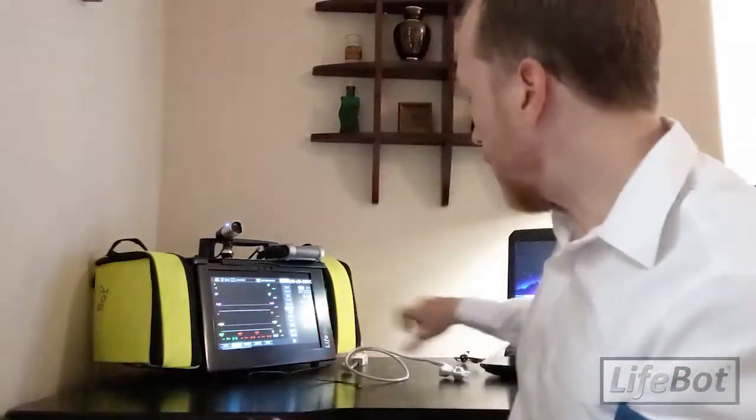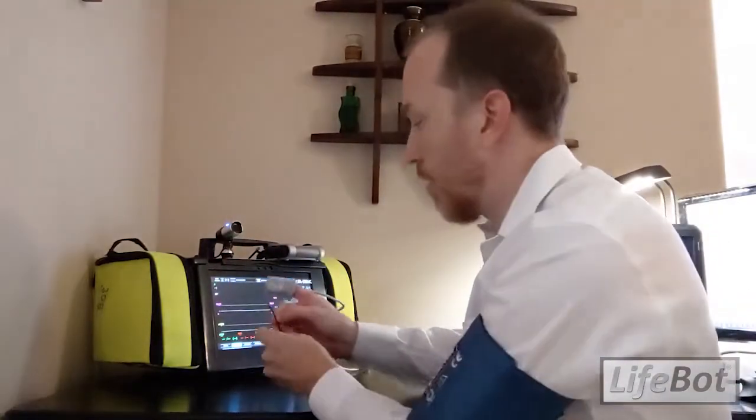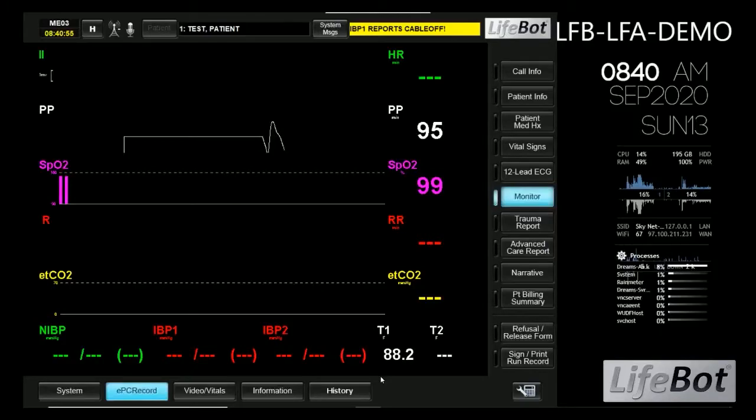Now it's time to connect to some of our peripherals so we can take our vital signs prior to calling a physician. I'll slip on the blood pressure cuff and the SpO2 sensor, and I'll just hold on to the temperature probe. As you'll see, the visualizations begin to populate. Now I'll take my blood pressure.